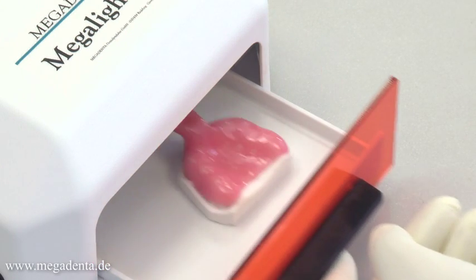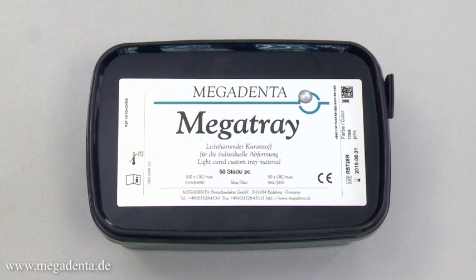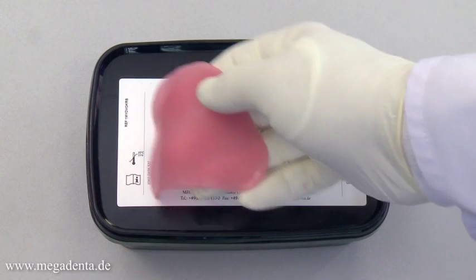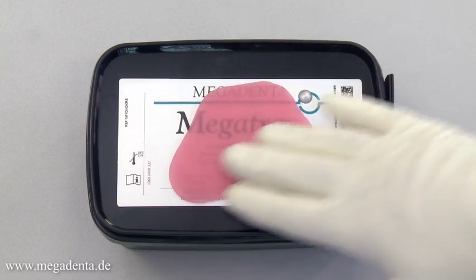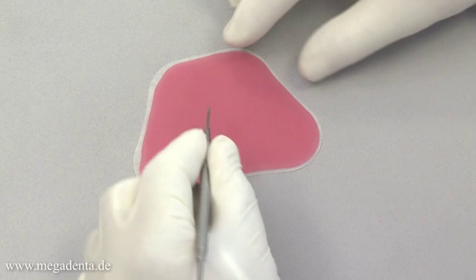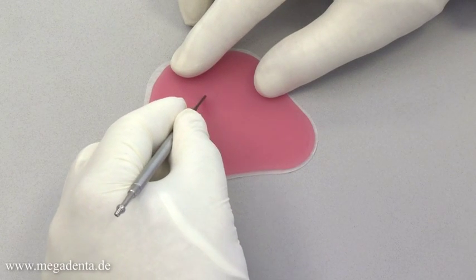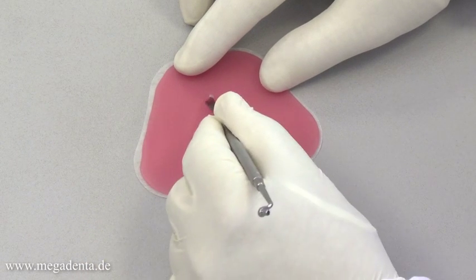The final individual tray is now ready for use. Megatray wafers have a thickness of 2.2 millimeters and are slightly transparent, allowing visibility of the prepared markings on the plaster model for a safe and correct cutting process. The universal shape of the wafer allows the use for upper and lower trays; cut out the lingual area to use the wafer for a lower tray.